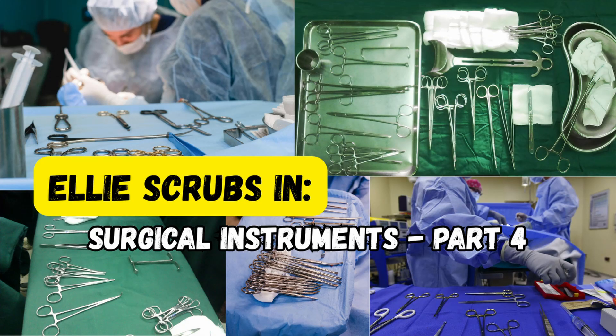Welcome back to Ellie Scrubs In. You're watching Part 4 of our Surgical Instrument Guide, your hands-on tour through the tools of the trade. Whether you're starting your surgical rotation, prepping for lab, or scrubbing in for the first time, this series helps you build real familiarity with instruments you'll actually use. Today, we'll cover 10 more general surgery tools — some bulky, some subtle, but all essential. Let's begin.